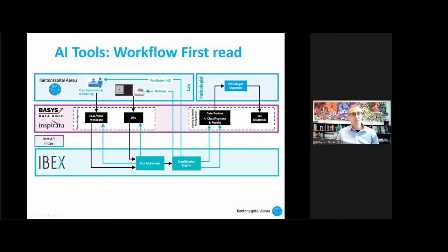Well, this is followed by the first read. Once we get comfortable with this one, that means everything goes into the AI analysis tools and the classification engine. And after everything has gone through the quality check and the various algorithms, it goes to the case review for the pathologist, and the pathologist finally signs it out and sets the diagnosis.